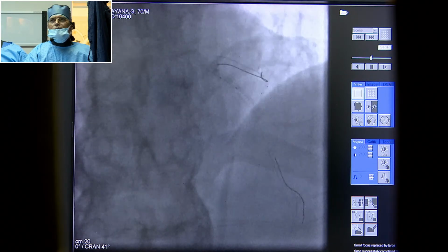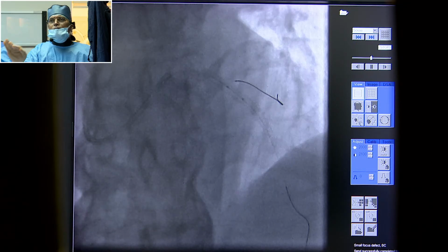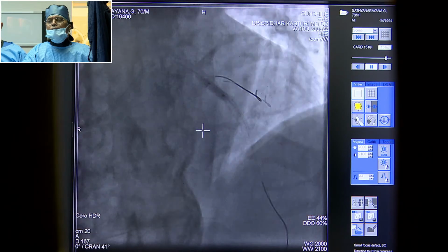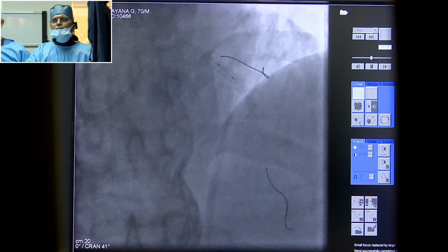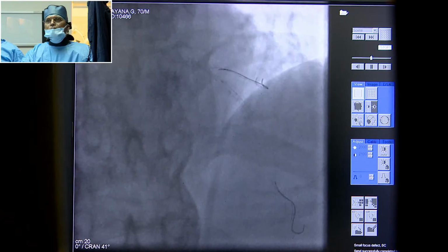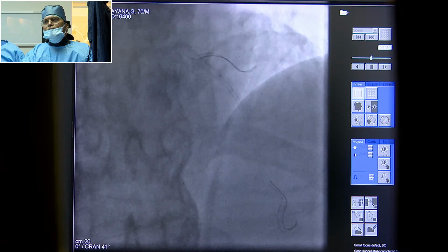Now pull the diagonal wire. Slightly push down. Do it now. 8. Pull the wire. Is it coming? Disengage the catheter. Not coming, I think. Wait. Now I will hold the catheter, you can pull out. If it is not coming, let me know. Is it coming? Yeah.